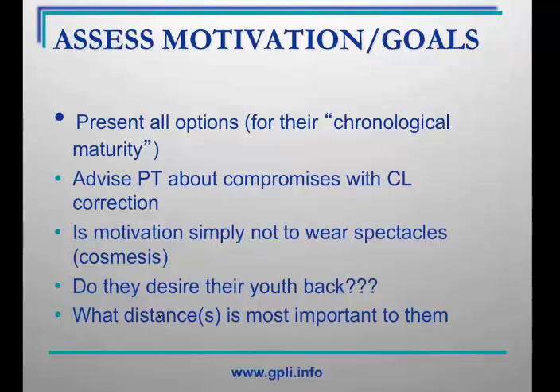It's the same reason that we don't guarantee the patient that they will not need over spectacles. There is occasionally a patient who desires them for reading fine detail, very small print, or perhaps to help with night driving. Although really the great majority of patients do not require over glasses. But this is essentially just like the restaurant that tells you there's a 20-minute wait and you are seated in 15 minutes. Our goal is always to underpromise and overdeliver.